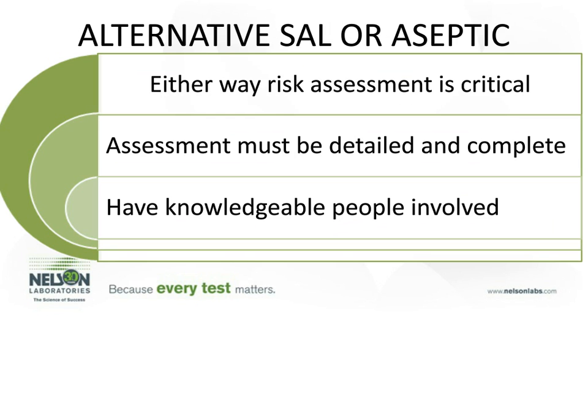So when looking at an alternative SAL or aseptic processing, in either case, again, the risk assessment is critical. It plays a critical role. And the risk assessment must be very detailed and very complete. And it's critical to have knowledgeable people involved. There are often people in even smaller medical device companies that are very familiar with risk assessments.